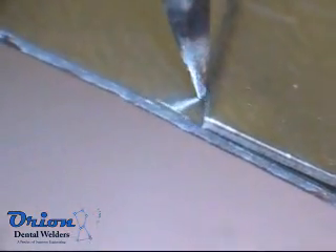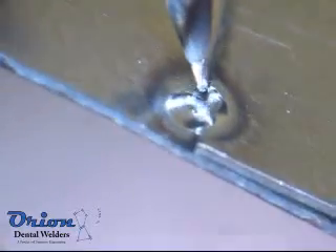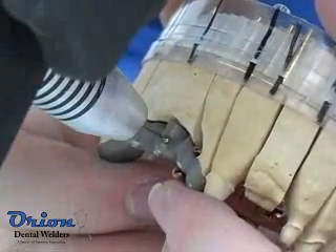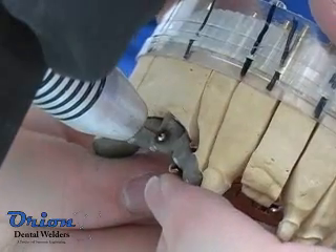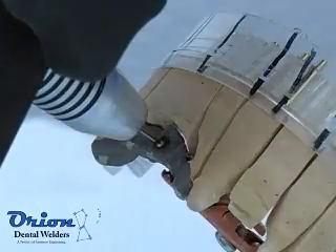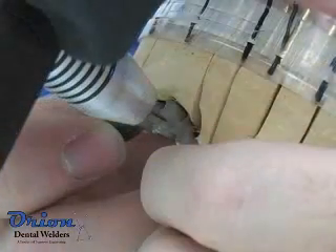The Orion microscope contains an optical shutter to ensure your eyes are protected during the welding process. Using excessive pressure on the electrode will cause the electrode to stick into the molten weld pool, or will quickly degrade the welding electrode with metal contamination.